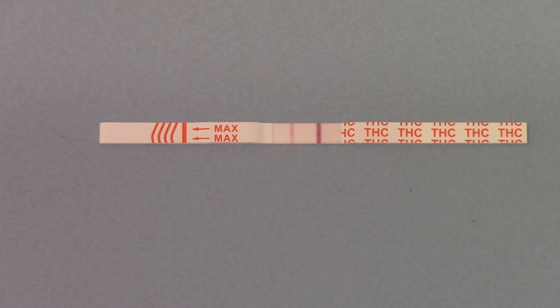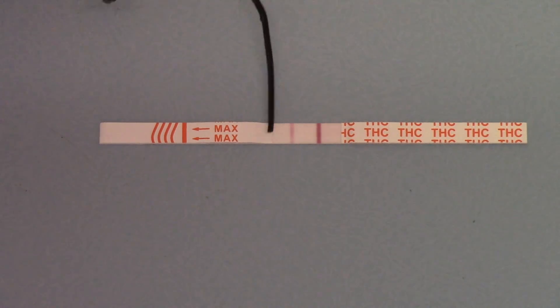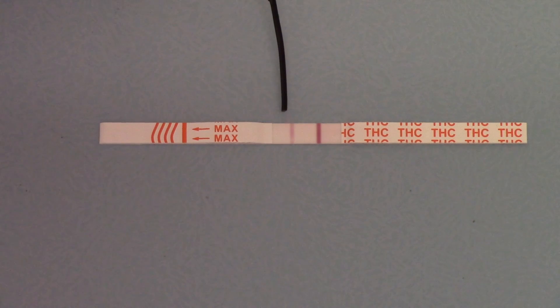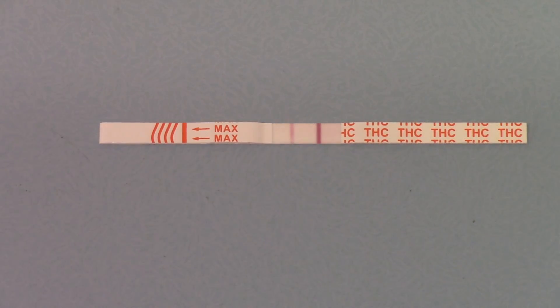So there you have it — the new All Test Ultra cannabis dip test, available from UK Drug Testing in single tests and packs of 50 for professional and business users. The result window has now completely cleared: a lovely pale background, a nice clean easy-to-read control line, and a test line — a clear negative result on the negative control solution this test was run on. Thank you.